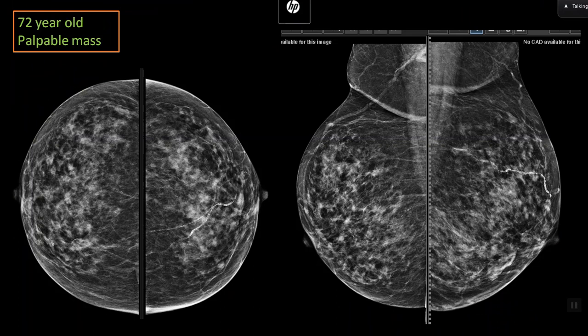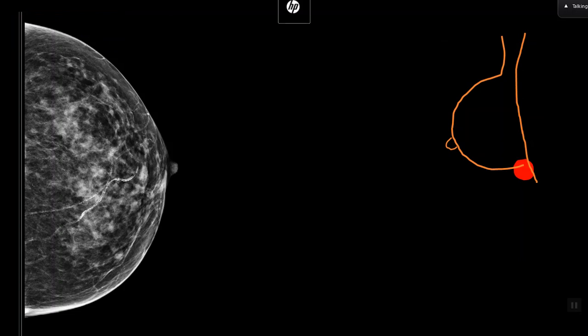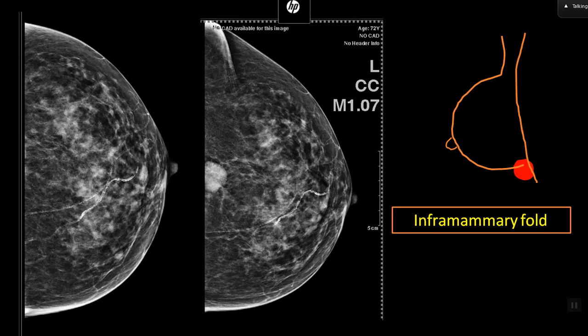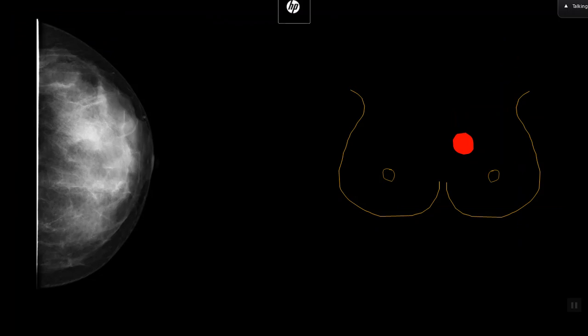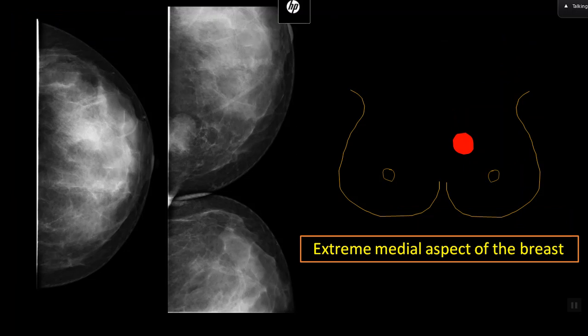Here is a classic example: a 72-year-old with a palpable mass. Looking at these mammograms, there is a subtle abnormality — increased thickening in the retromammary zone on the MLO. But what do you do next? She has a palpable mass, so logically you call the lady in and ask her to show you where the mass is.